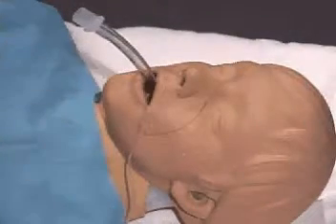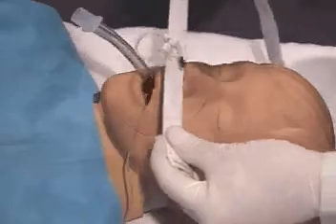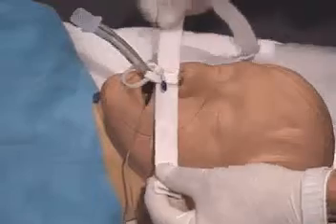Clean the face to remove moisture and secretions. Place the cable tie loop over the head of the endotracheal tube and pass it down to the desired markings on the tube. Do not include the pilot balloon tube in the loop.